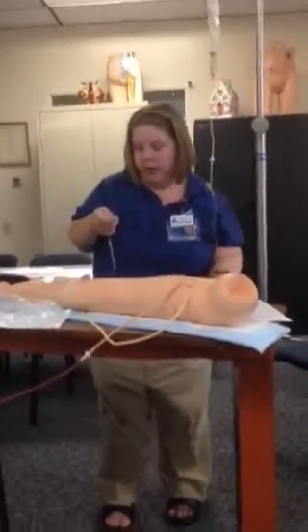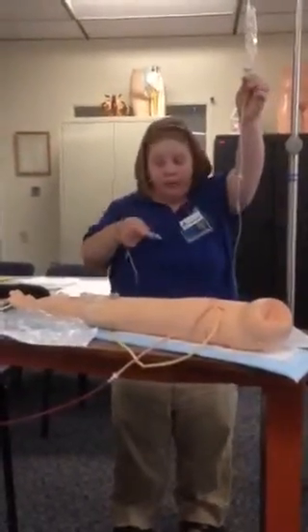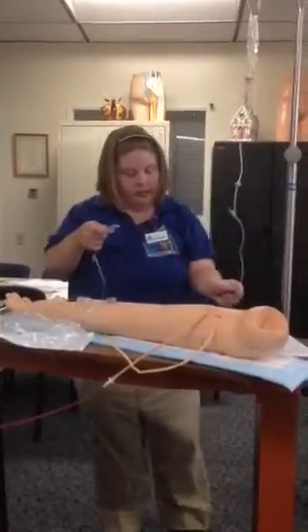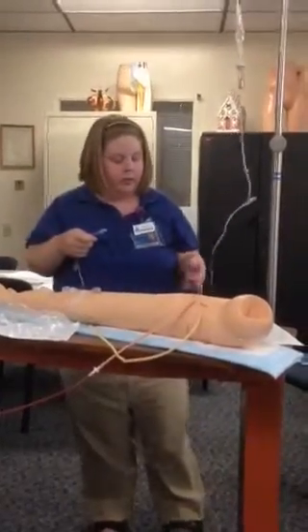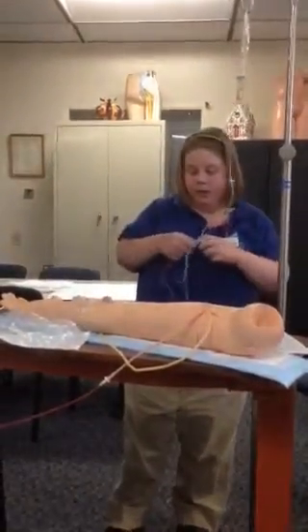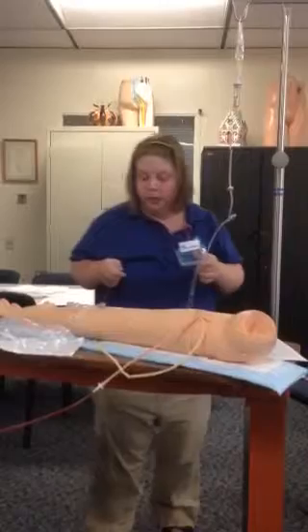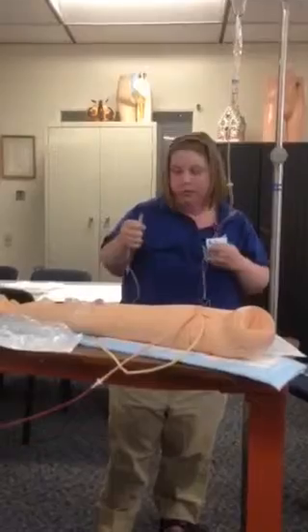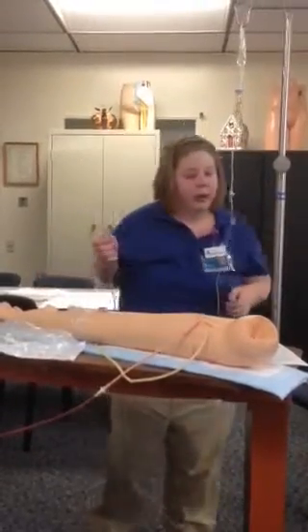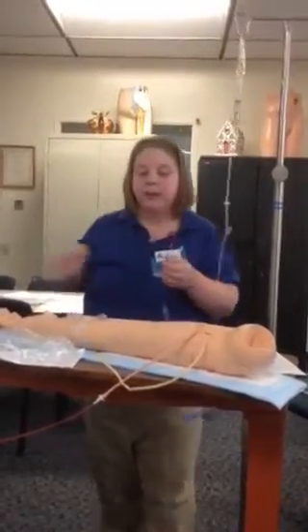Gonna unclamp it. Priming it. Not letting too much come out. I would not have let that much come out. Now I would clean my patient's site again.